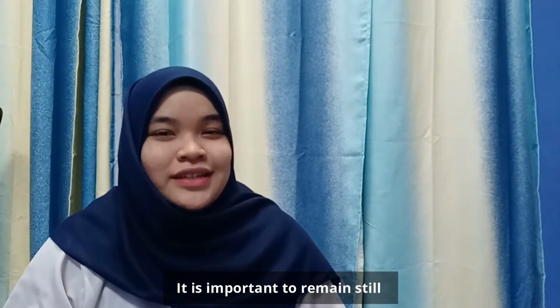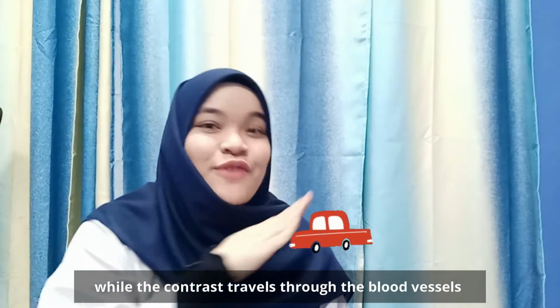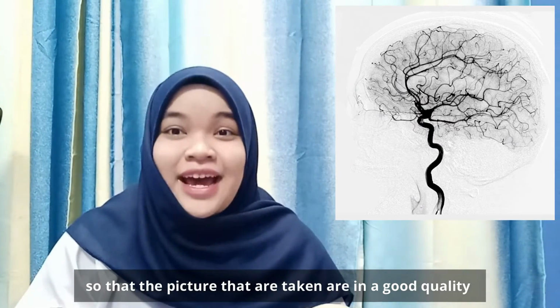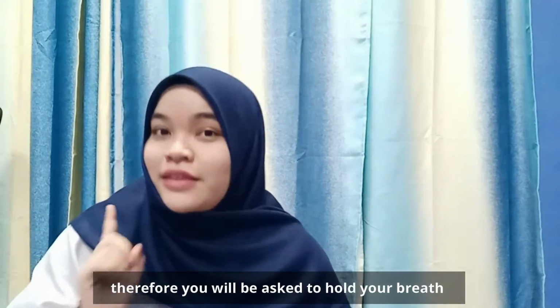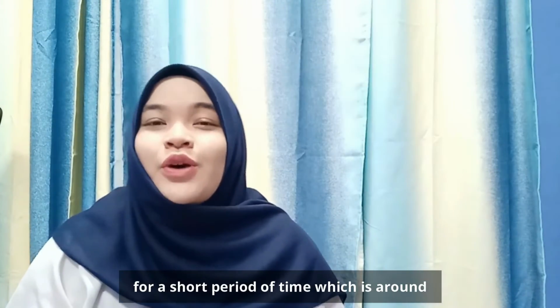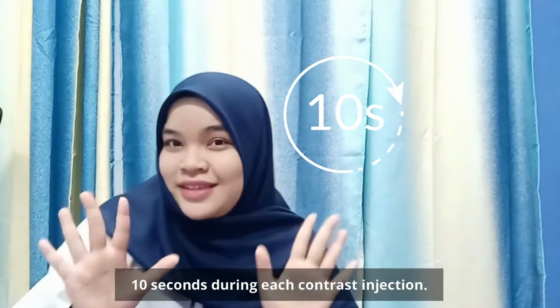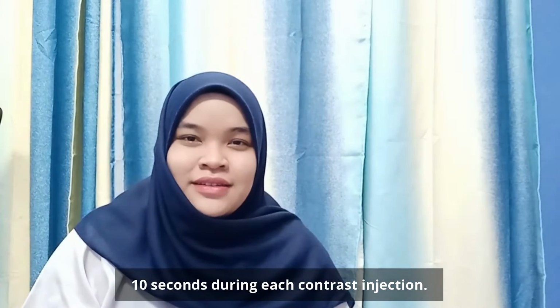It is important to remain still while the contrast travels through the blood vessel so that the pictures taken are of good quality. Therefore, you will be asked to hold your breath for a short period of time, which is around 10 seconds, during each contrast injection.